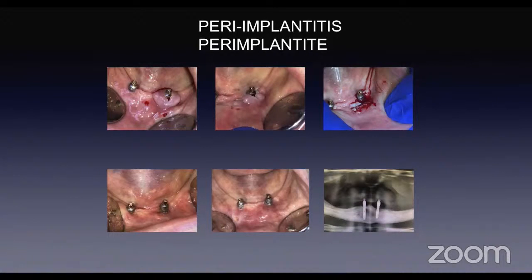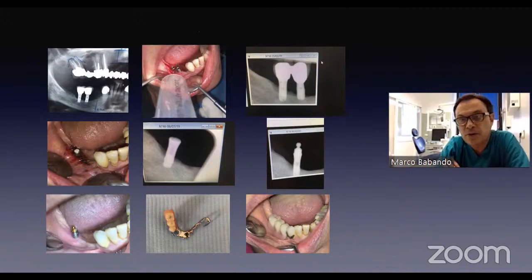So this is a case of peri-implantitis, quite important. There's an old lady with different pathologies. So she underwent decontamination of the implant with ozone, cleaning the surface of the implant, and we have obtained a great healing. So we can see the non-inflamed tissues are there. We need some adherent vestibular gum, but in a second time we will work with connective tissues as we have dominated the infection. So I can explain how easily we can decontaminate implants.